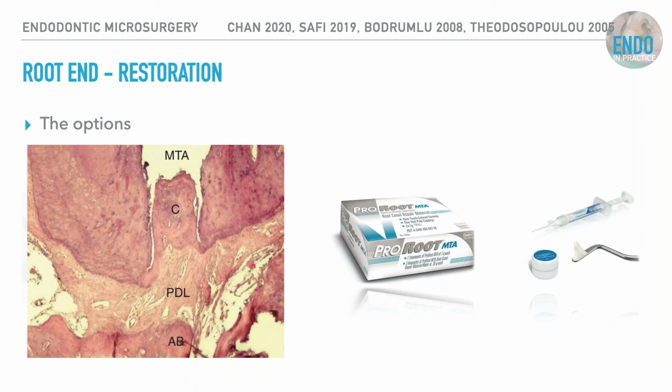And recently, the putty, so the putty is a bioceramic putty. It's a lot easier to handle than MTA, a lot easier to handle. Until recently, it was mostly animal studies, but even on CBCT diagnosis of healing, so SAFI, last year, it was a 92 versus 95% success rate. So the bioceramic putty is definitely a successful alternative, and also from a procedural point of view, it keeps the procedural time down and is just easier to manipulate.